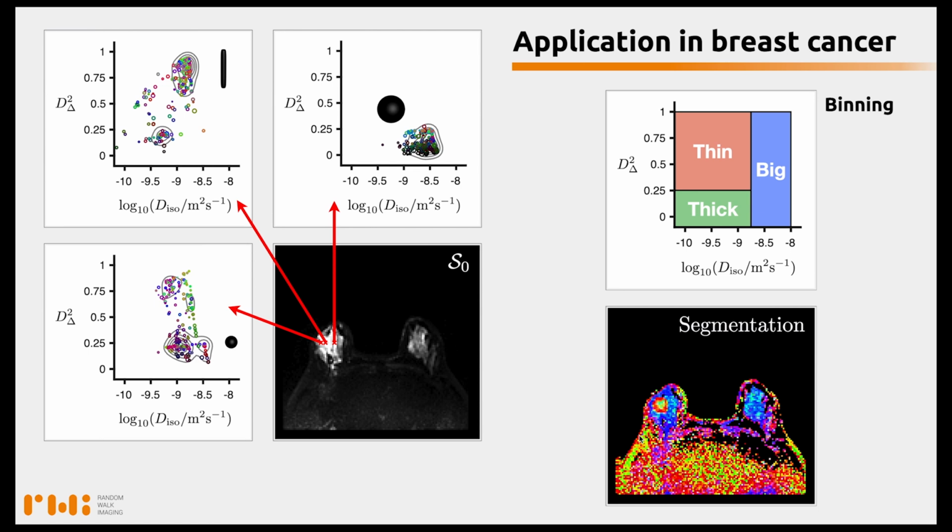If you forget the bottom of this map, which for practicalities of breast imaging has quite a low signal-to-noise ratio, SNR, the healthy breast tissue here looks blue or cyan, which is a mix of blue and green. This tells us that diffusion has high isotropic diffusivity in the blue voxels, and is a mix of diffusion environments that have low and high isotropic mean diffusivities without having a very high anisotropy.